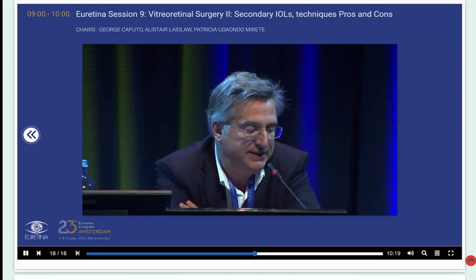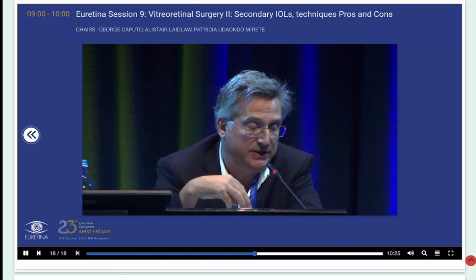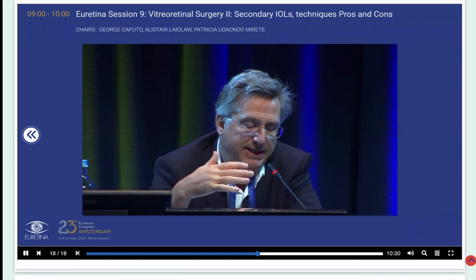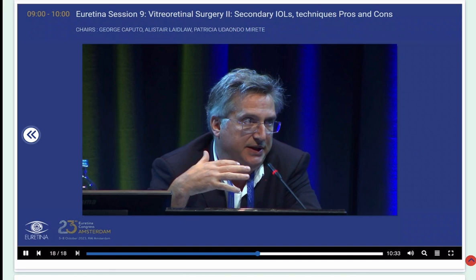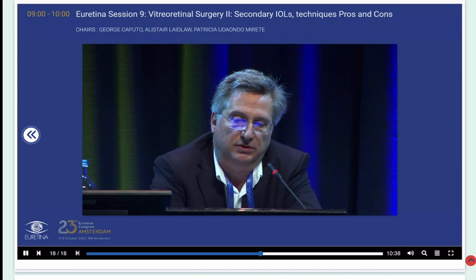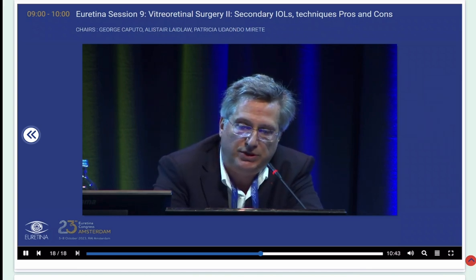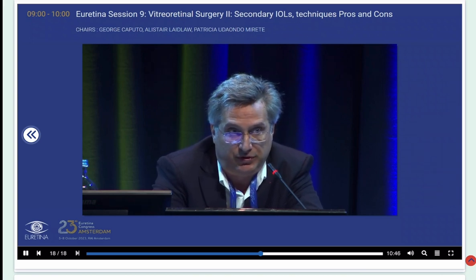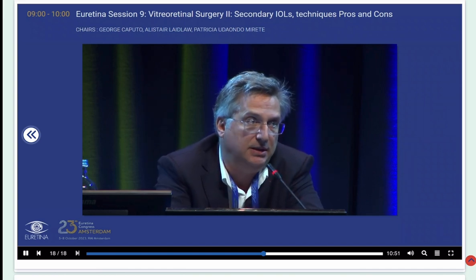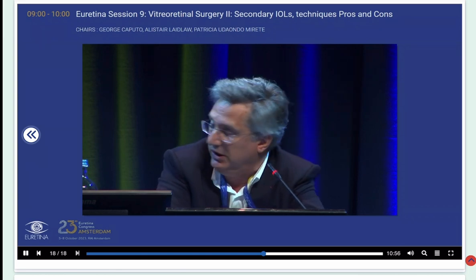Like in Marfan syndrome, what we do is we start by removing the entire lens with the capsule with an anterior approach, anterior vitrectomy, and we wait till the child is maybe 7, 8, 10 to consider IOL implantation. In those cases we use either a sutured IOL or eventually Carlevale in older patients. So we really don't recommend that.